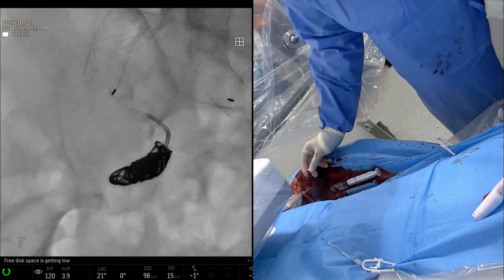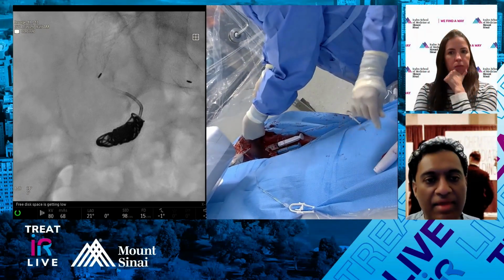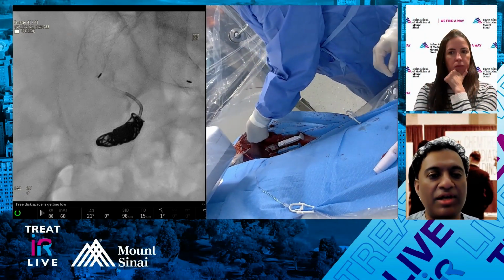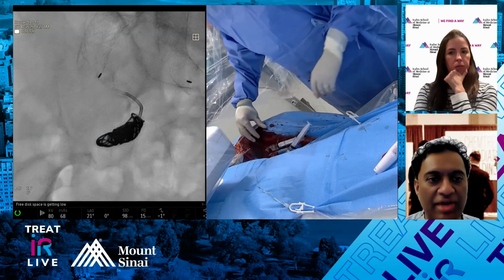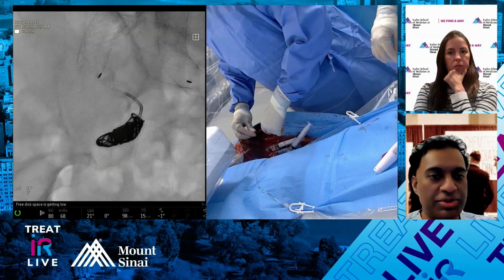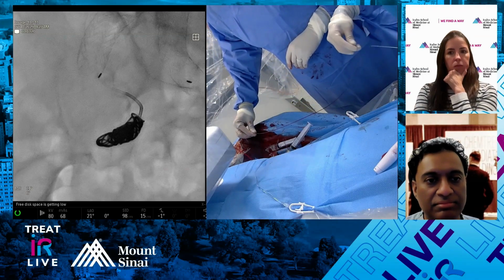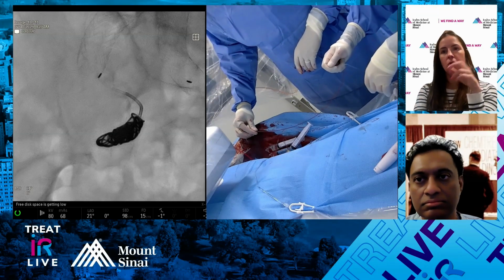The key is to open up the anterior posterior division when you're deploying distally, and then the external internal bifurcation proximally, with a below threshold injection, so you see the external. If you get in trouble and the coils start to migrate into the external, you just trap it with the stent. And then while they're getting this, either Rahul or Goegy.